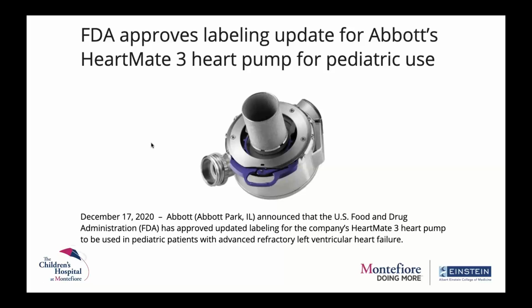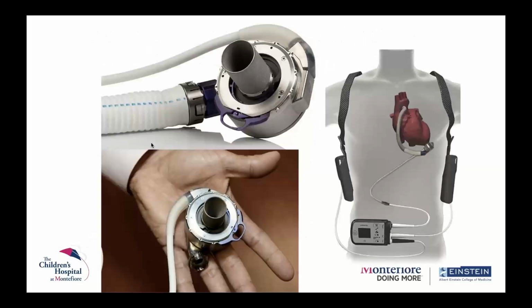Recently, because of the data that was provided by the Action Network, FDA approved the labeling of Abbott's HeartMate 3 for pediatric use, which was a very important announcement for the pediatric heart failure world. And as you can look, this device is quite bulky. That is an adult-sized hand down there. So it is a big device, so it can only be implanted in big-sized patients, not in our babies, unfortunately.